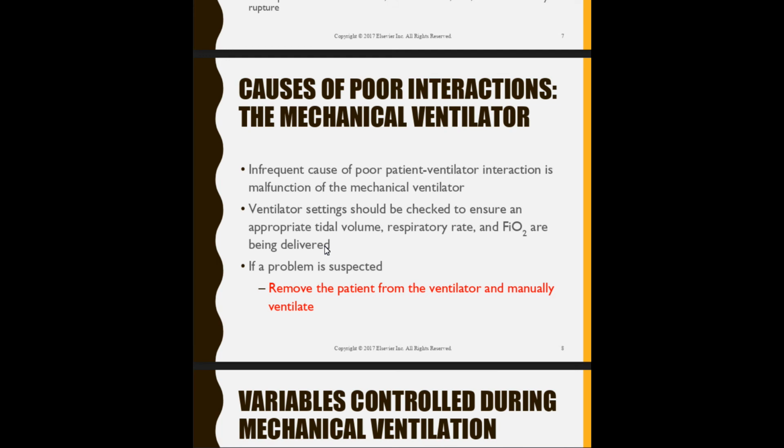It might just be one in every bedside. So if you think there's something going on, you're pushing buttons and nothing's responding, feel free to take off the vent circuit and start bagging the patient. Make sure that they're coming back up in terms of their O2 sat.